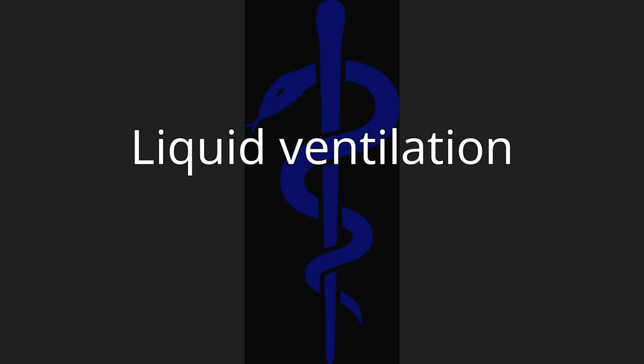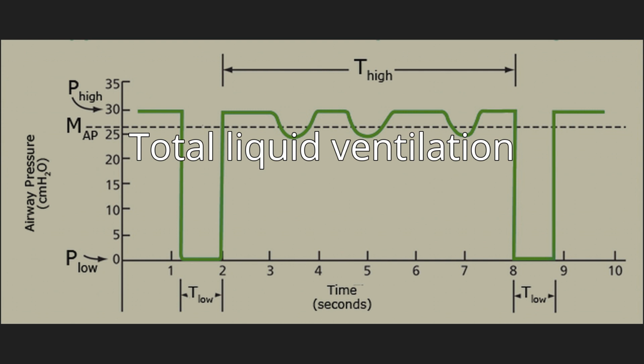Despite its theoretical advantages, efficacy studies have been disappointing, and the optimal clinical use of LV has yet to be defined. Total liquid ventilation. In total liquid ventilation (TLV), the entire lung is filled with an oxygenated PFC liquid, and a liquid tidal volume of PFC is actively pumped into and out of the lungs. Specialized apparatus is required to deliver and remove the relatively dense, viscous PFC tidal volumes and to extracorporeally oxygenate and remove carbon dioxide from the liquid.